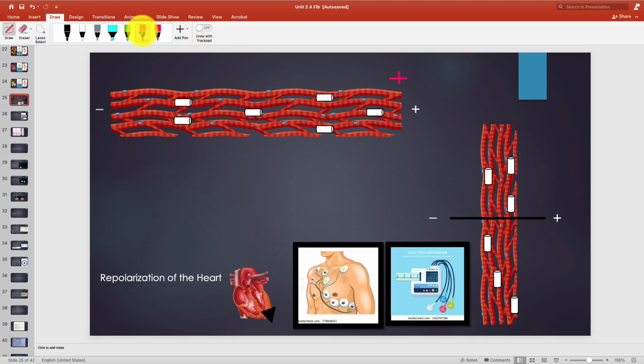So all the positive stuff that was over here is going to start moving backwards, and we're going to start to get repolarization going this way. These little lines are representing negative charge, right? So everything inside the cell, everything inside the heart is negative, and it's moving in this direction. So where is the negative charge moving towards? Well, it's moving towards the negative electrode. And earlier I said that's a flat line and no deflection, but that's not true. It's a positive upward deflection.